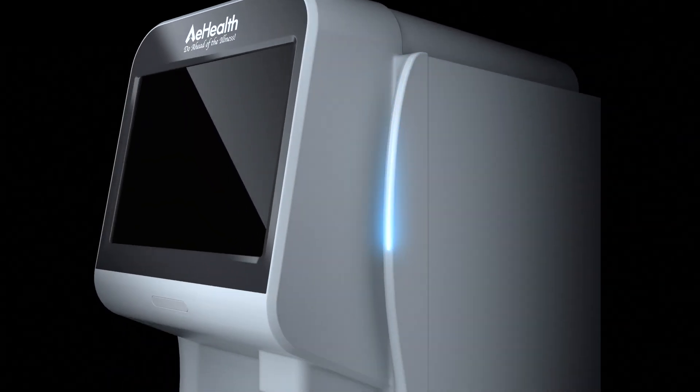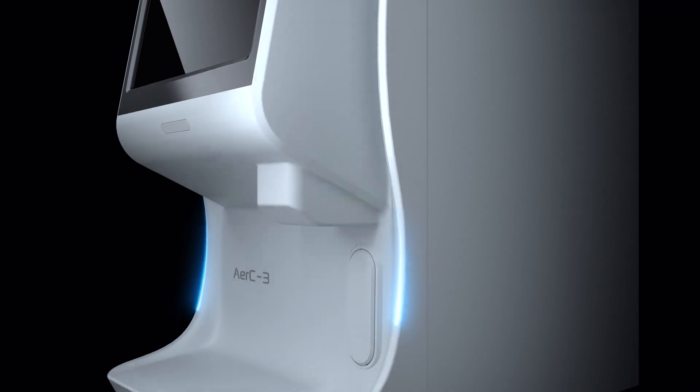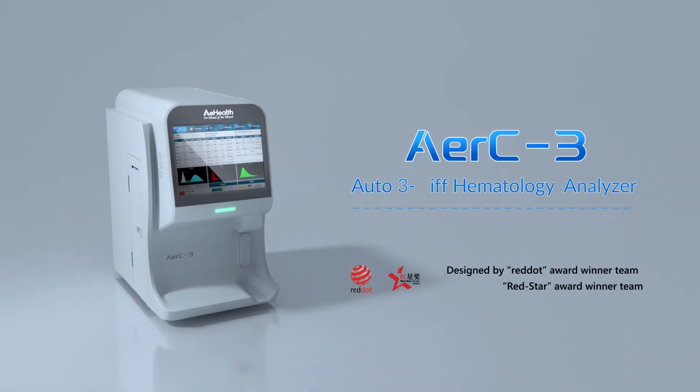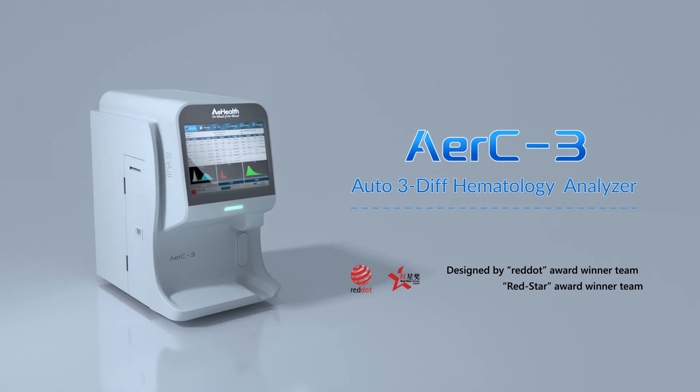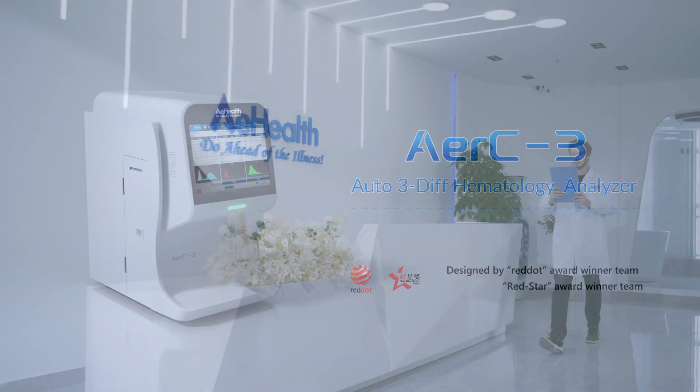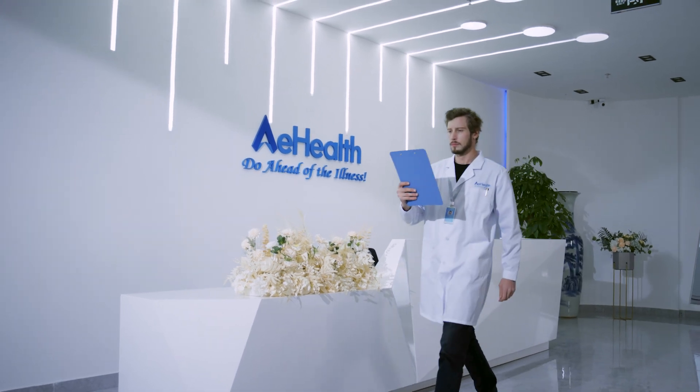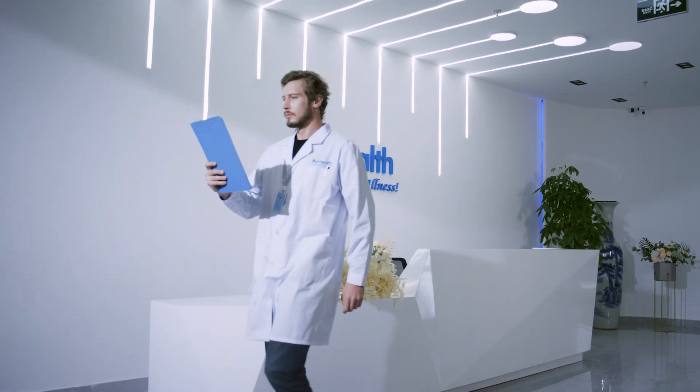AirC3 is a new generation advanced three-part hematology analyzer with innovative technologies and special structure, achieving higher accuracy and reliability. It is an ideal choice for physician offices, clinics, and ambulatory care centers.